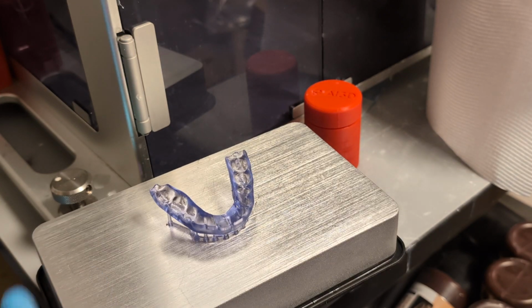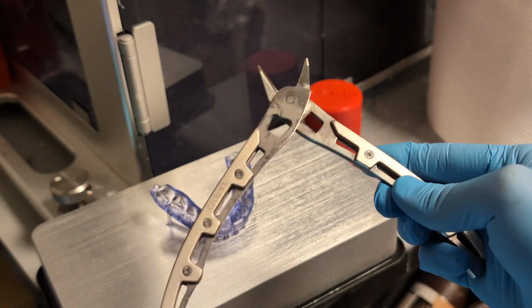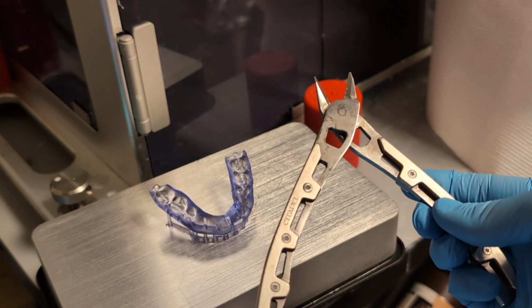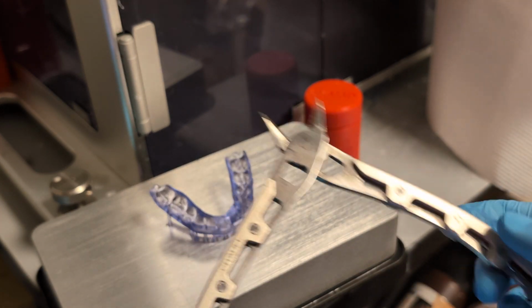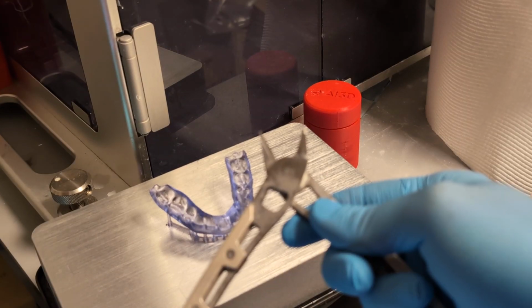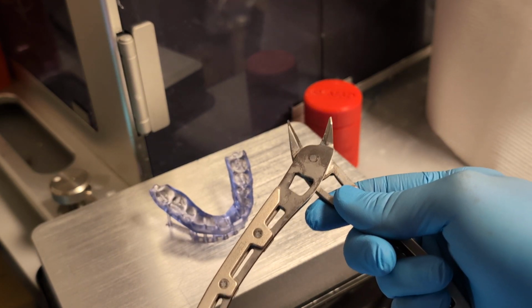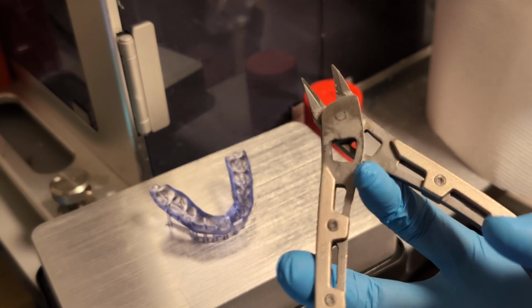First things first, I would highly recommend a really good pair of sprue cutters. These are the Citadel ones. Anyone who's collected Warhammer would have probably seen something like this. I really like these. They open super wide, and they're really sharp at the beak. These ones are at least 4 years old, and I just chuck them in the Pro Wash. They're pretty expensive, but definitely well worth the money spent.